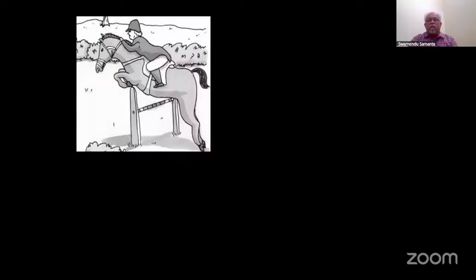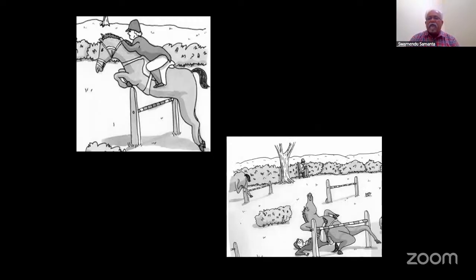So I think bone tumor radiology is not very complex. If you can answer all the 7 questions, like which bone or which part of the bone has been affected, what is the age of the patient, what the tumor is doing to the bone, what the bone is doing to the tumor, what is the matrix, and what surrounding tissue is there, where there is calcification. If you answer these 7 questions, you can jump like a master. But if you don't follow the principle of understanding the X-ray, probably you can stumble through.